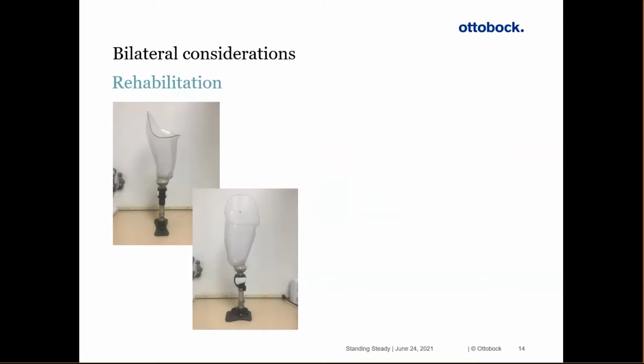So they should be able to go about the things they want to do during their day in their stubbies, whether that is just going to the grocery store or playing on rocks and walking in a small stream. It can vary drastically depending on what the user wants to do.